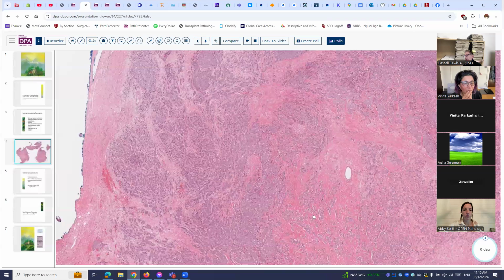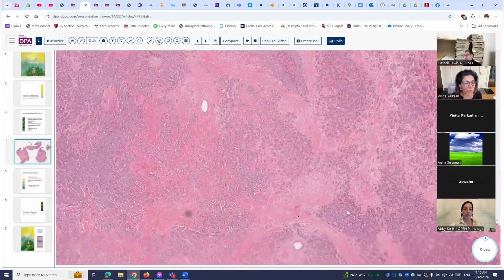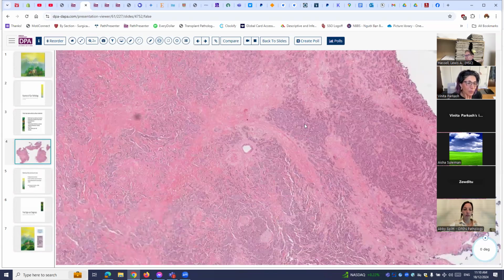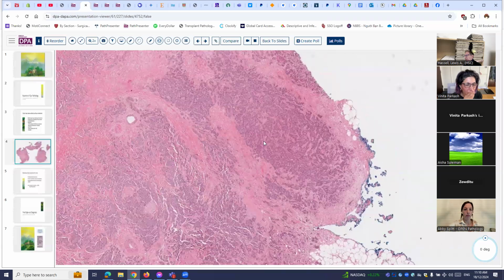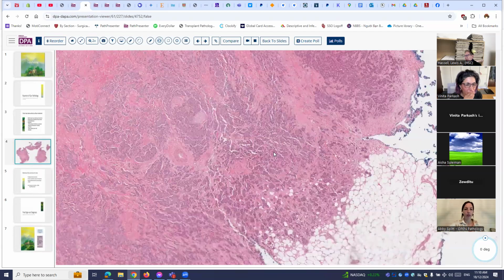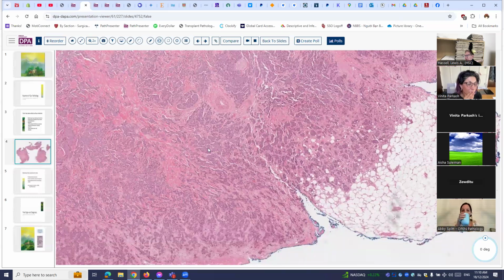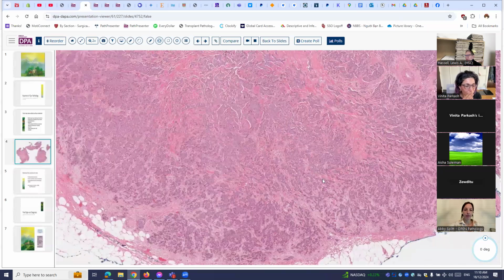Oh, very good. So I think carcinoma arising from the ectopic breast. Yeah, sort of an ectopic breast type of tumor could easily have this type of pattern. So markers that you might include for breast carcinoma, like GATA3 and ER, PR and so forth. So that actually is the diagnosis in this case. It's a mammary type of carcinoma occurring in the vulva. And sometimes that can throw us off.